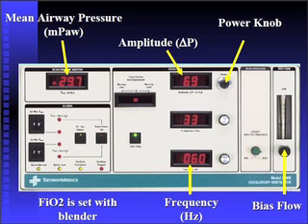Okay, here's the face of the 3100B with some of the labels on it. The first thing you're going to do when you set this up is set the bias flow circled here. Now, Pilbeam and Cairo's book on mechanical ventilation said the bias flow should be set between 25 and 40 liters a minute, for example, 30 liters a minute.